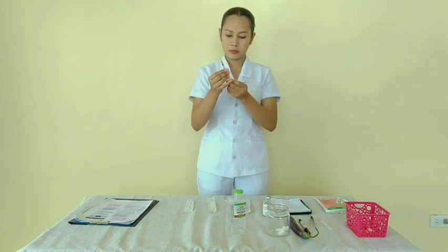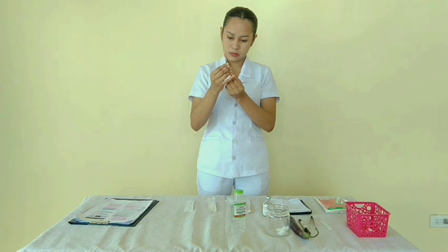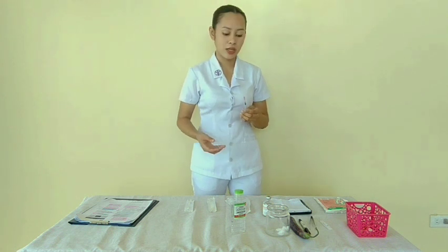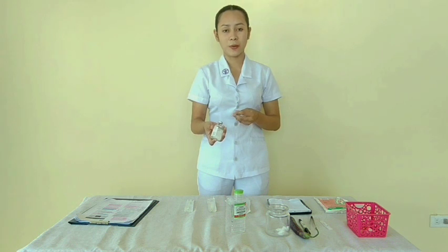Then draw into the syringe the amount of air equal to the volume of medication to be withdrawn. Then, after that, carefully insert the needle into the upright vial through the center of the rubber cap.